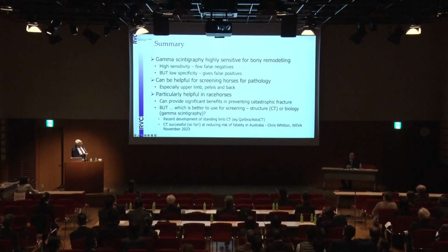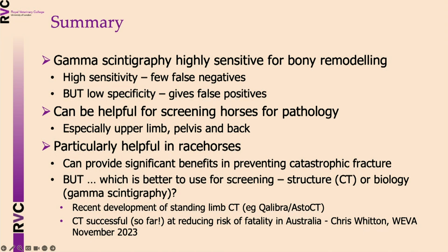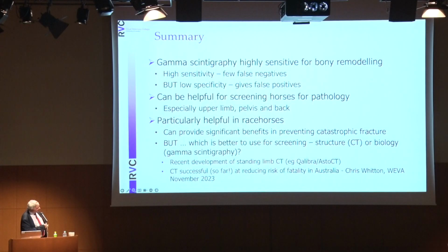But in recent time, there has been a greater focus on identifying structural abnormalities rather than changes in metabolism that gamma scintigraphy shows. Especially with the development of standing limb CT, such as these commercial systems.